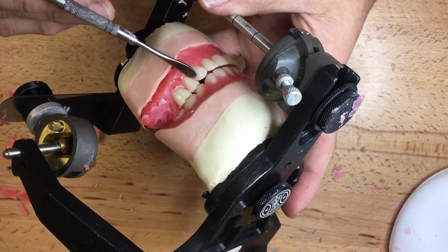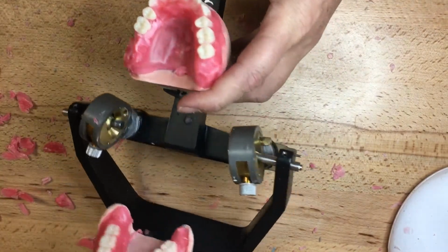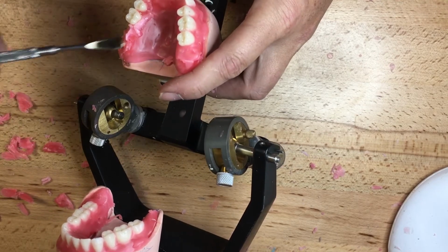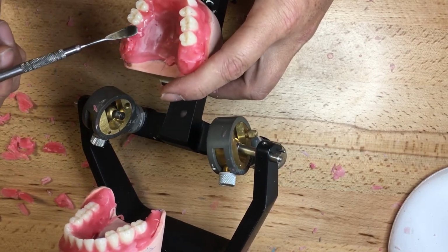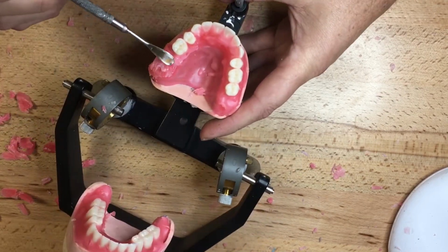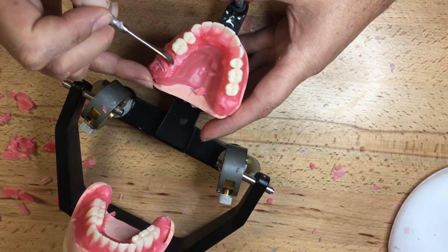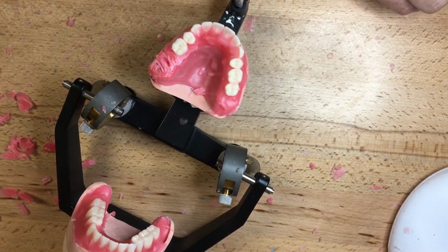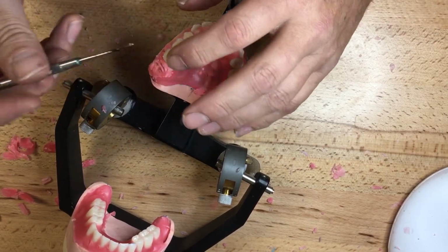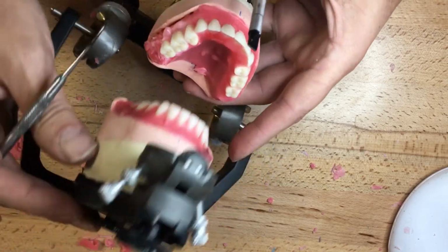Now, there's no time lapse here. This is done real time, so I haven't checked the counter, but I'm guessing for a full upper and lower denture setup, maybe 45 minutes to an hour. I mean, it can be done in under a half hour, but I'm thinking realistically 45 minutes to an hour. I'm just guessing. We should count the timer on all 4 segments of upper 6, lower 6, lower 6 posterior, and upper 6 posterior.